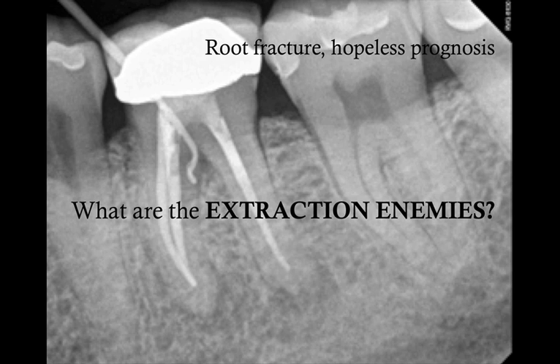The question again is, what are the extraction enemies? What are the challenges that you are seeing prior to extracting this tooth? And I'd like you to look only at one radiograph and get the maximum information from it. And I promise you that you will be much more prepared for the procedure and you'll become better and faster. So I'm going to give you like 3 seconds to look at this radiograph and just think about a few extraction enemies, some challenges that you're seeing with extracting this tooth.